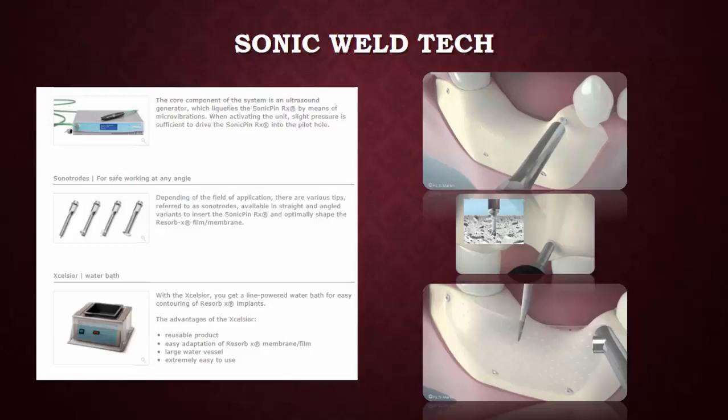It's a very nice technique, provides a stable membrane, a stable bone graft, and it's a good space maintainer for ridge augmentation.